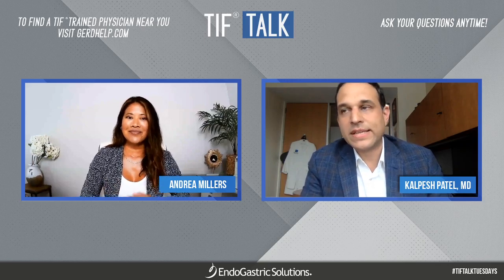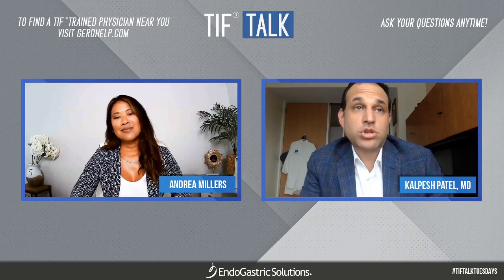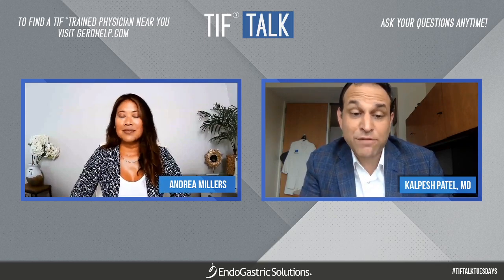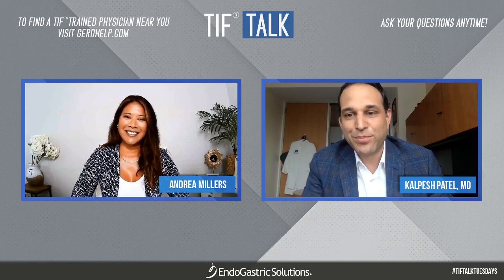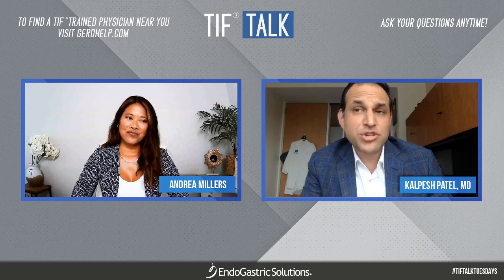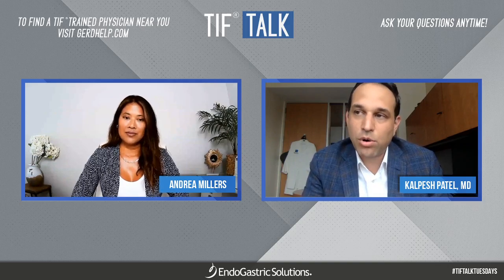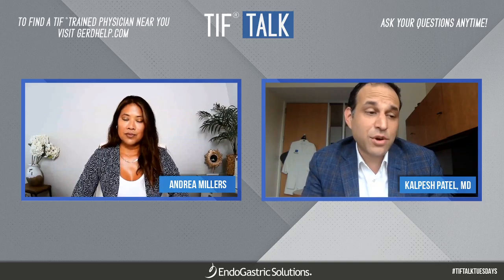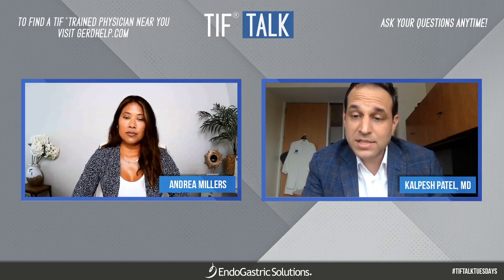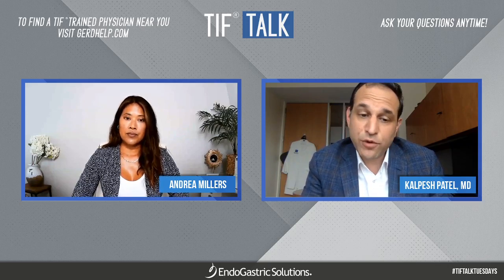Very important points. I've met a lot of patients who've told me that they never had surgery because they were more worried about the recovery than the actual surgery. So I think it is a good point to talk about. The procedure itself begins as an outpatient procedure. You arrive to the outpatient center. We typically advise everyone to prepare to spend 1 night in the hospital. It doesn't take more than that, and that's really more for comfort.